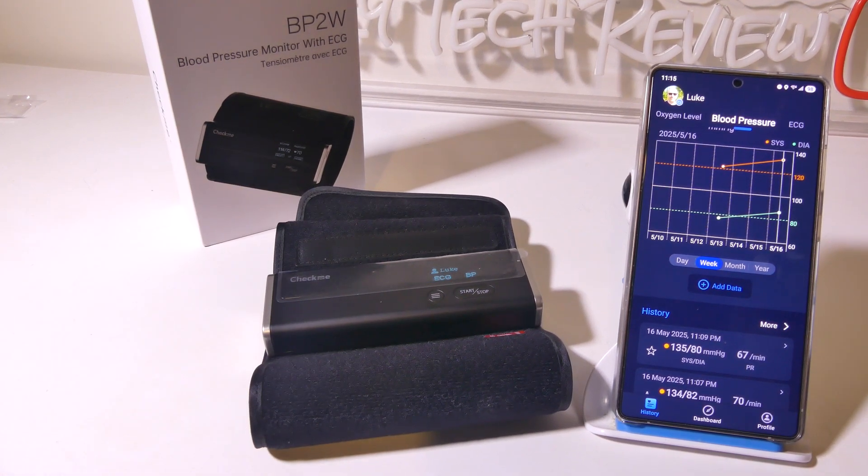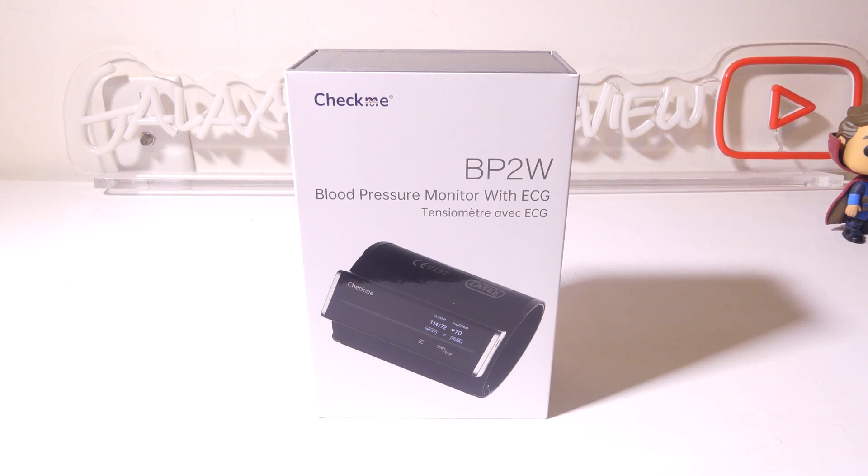CheckMe has done a great job with the BP2W and the vHealth software. That's my review of the CheckMe BP2W blood pressure monitor with ECG function. You're basically getting two devices in one. It works very well, and with the accompanying vHealth app it syncs all your data so you can keep it in one spot and share it with your healthcare provider if needed, or just continuously monitor your own health. Overall, I had a great time reviewing the BP2W and I'm definitely giving it a thumbs up. This was Luke from Galaxy Tech Review — I hope you enjoyed my review and I'll check you guys out on the next one.